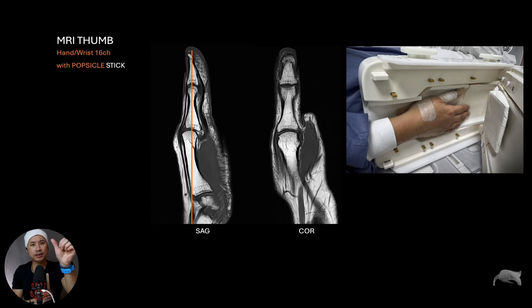It's easy to place this stick along the thumb and then tape it. By doing that you are fixing your thumb all the way. As you can see here, this is on a healthy volunteer. Using this coil can be a little bit difficult because if the hand is very big, it doesn't always fit inside the coil and the thumb may not lie correctly. Nonetheless, with this popsicle stick you can see the thumb is a little bit more straight, making positioning much easier.